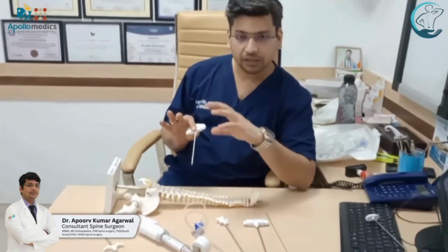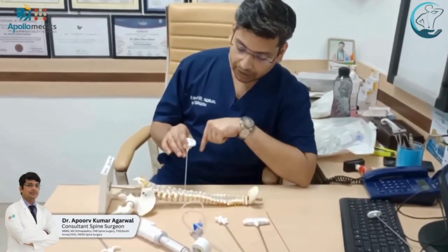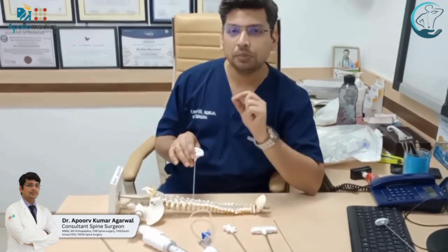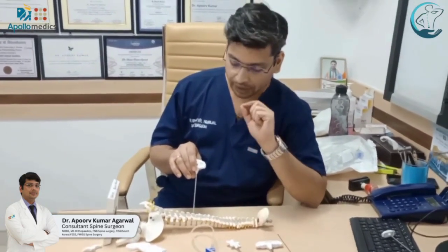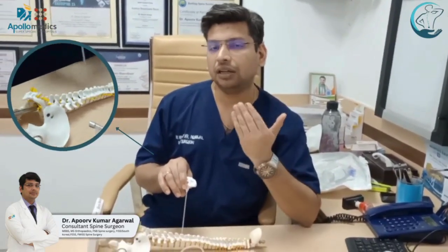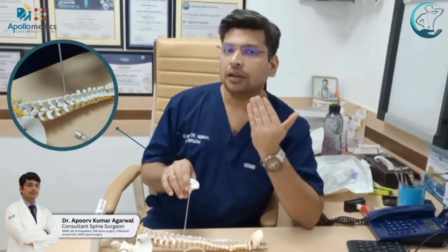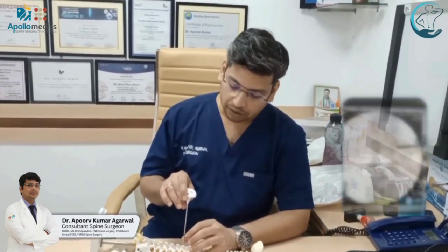Under C-arm guidance, we first locate our fractured vertebral body and thereby make entry into the pedicles. We do this balloon kyphoplasty through the pedicles, moving into the vertebral body. We create our entry point by locating the pedicles precisely, ensuring we enter through the lateral wall of the pedicle under C-arm guidance, confirming with AP and lateral views.